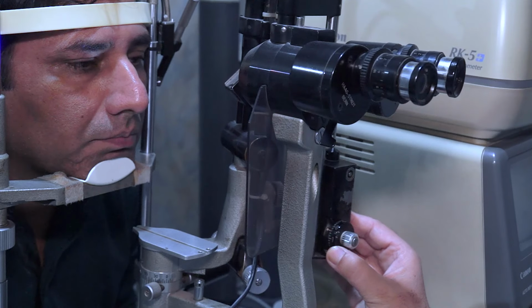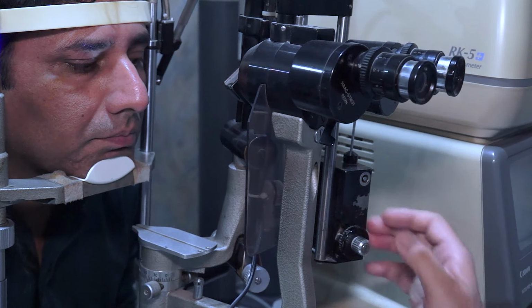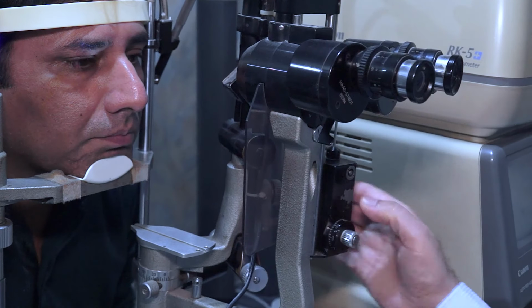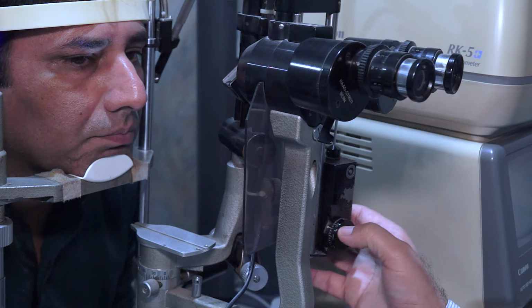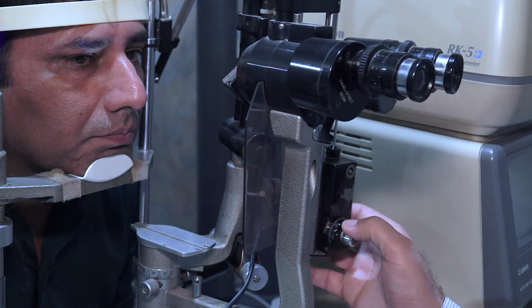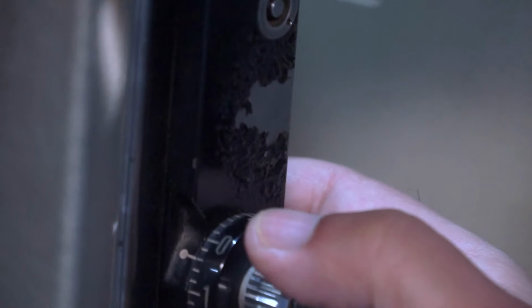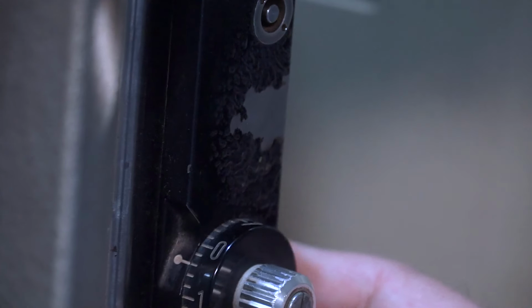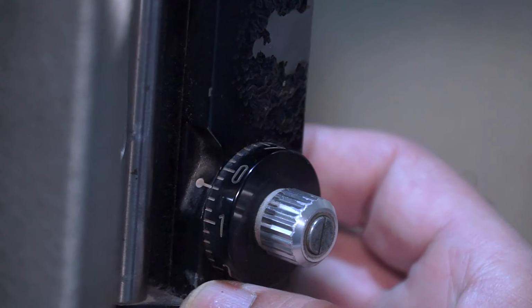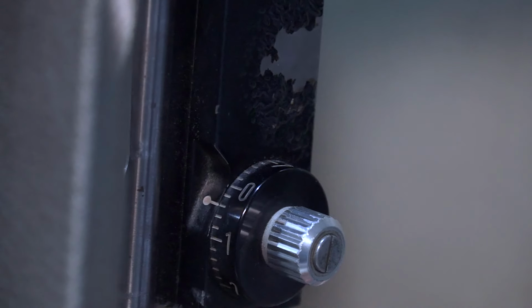So this is how we do a slit lamp examination, and with this we can almost complete the examination, except that we need a few more clinical methods for other diseases to diagnose. But the anterior segment and the fundus examination, in 90% of cases we can examine with this slit lamp.